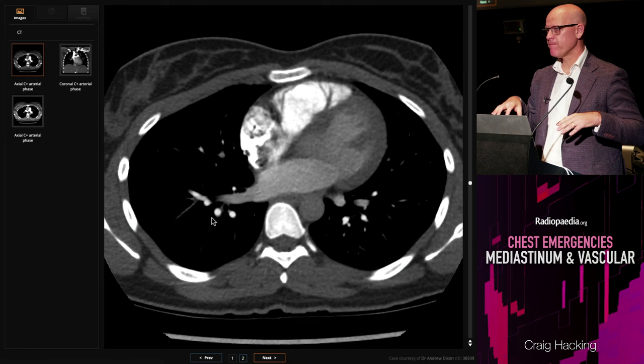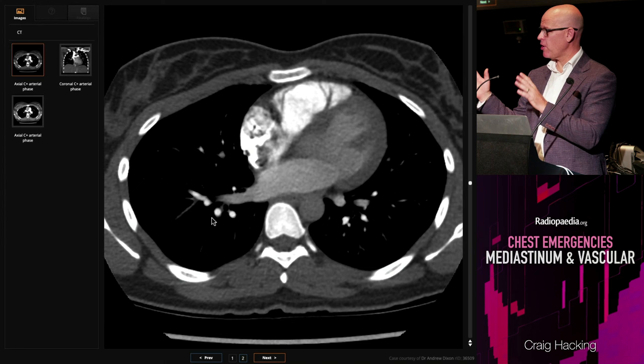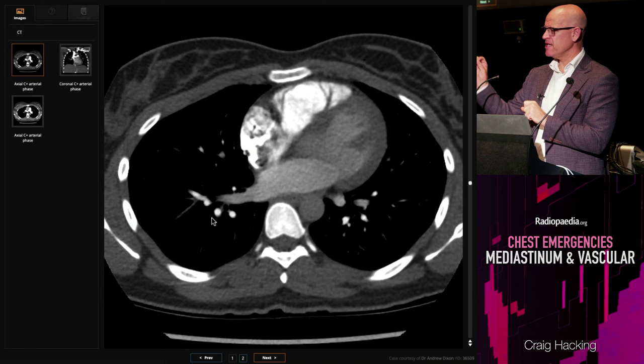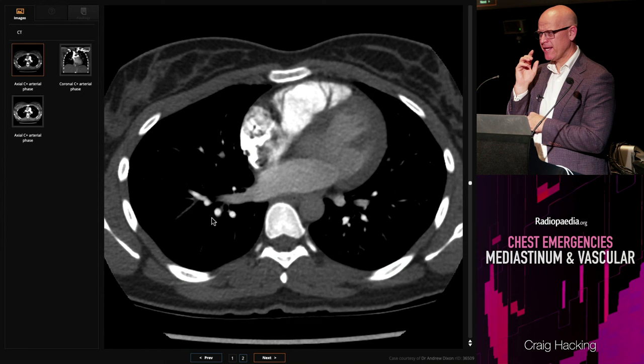The other important point is that the majority — 90% — are in the lower lobes. Bigger lungs, more blood volume, maybe gravity. It's important to know that those two percentages exist, because when you see a tiny one up in the periphery of the upper lobe, you might wonder: is that really a PE? Use those rules and you might be able to get around that problem.